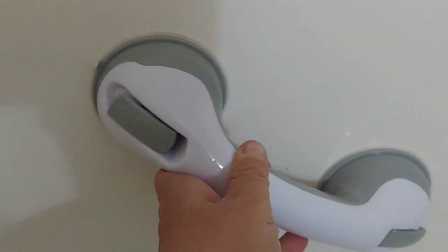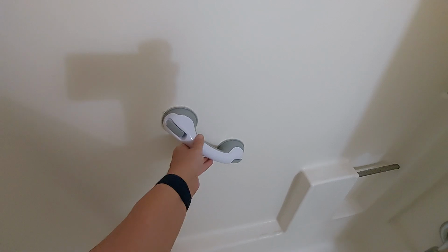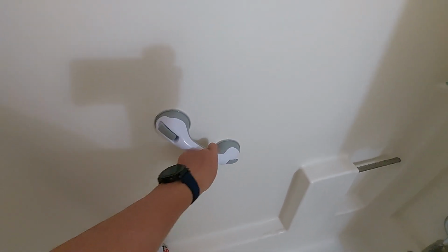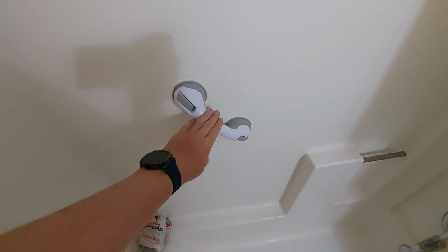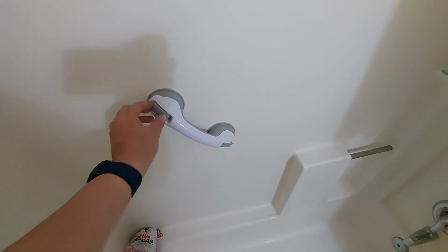I like to use the palm of my hand to push down on those locks. Those create a lot of suction. Really pull on those suction cups. They're just rubber. Now, you can use this. You want to make sure that you've got it secure before you put weight on it. But now you could put one here and have any bathroom almost have these handles.